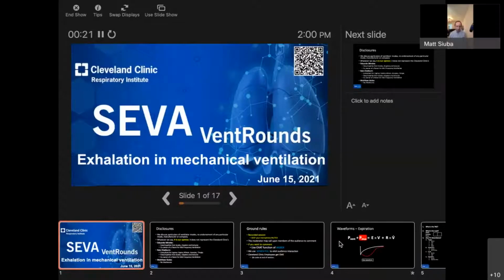My name's Matt Siuba. I'm one of the staff at the Cleveland Clinic working alongside Eduardo and Rob in terms of doing some ventilator education. Today's SEVA VentRounds, we're going to talk about the exhalation phase of mechanical ventilation.